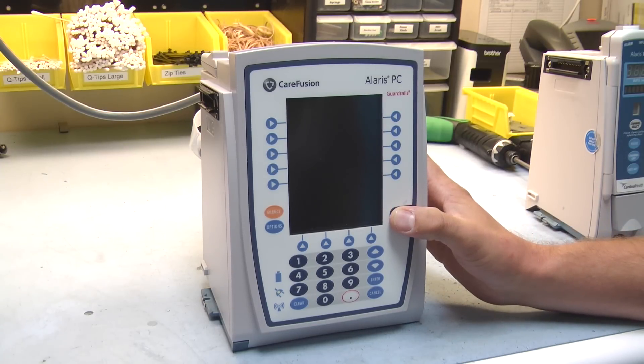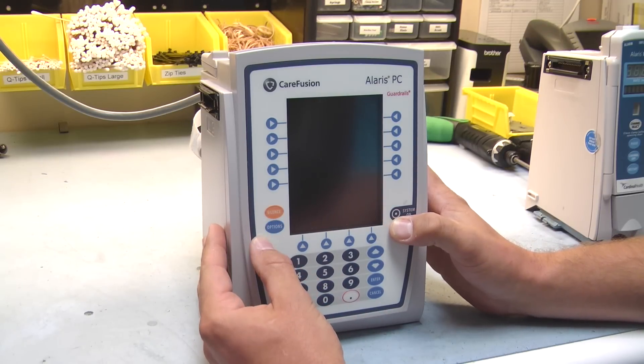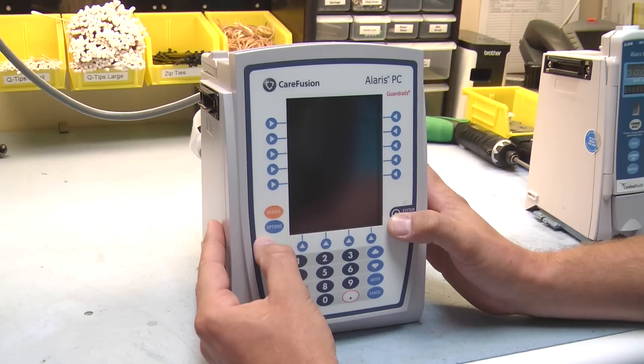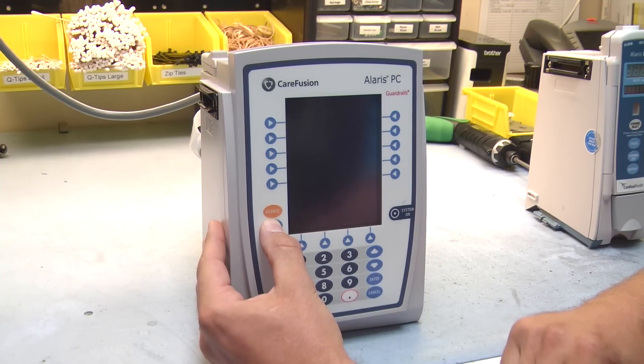The first option we're going to go into is your clinical settings. To get into that menu, you're going to hit your system on key, and while doing that you're going to hold your options key. That's going to bring you into your configuration menu.